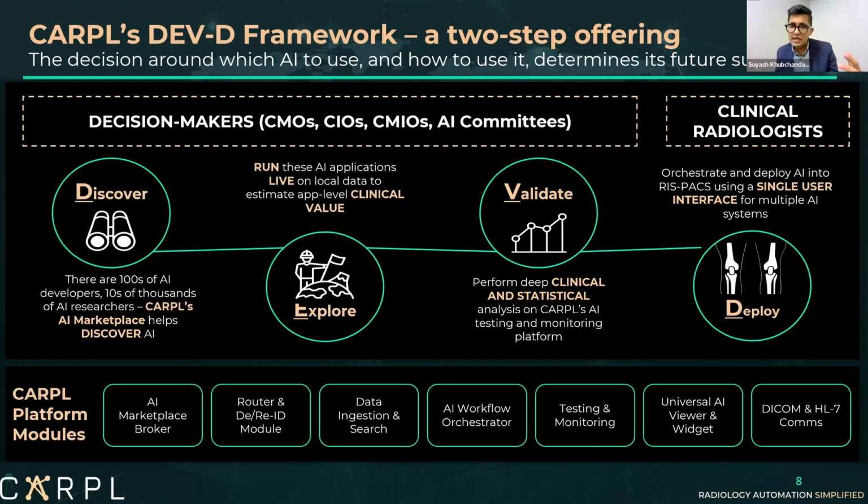Now, we're seeing in the ecosystem a lot of tools that look at oncology screens come up extensively. And that's where we find that while a radiologist may have all of these outputs sitting in their PACS system, let's say there's a lung nodule detection tool, it's detected 10 different nodules on a particular study. As a radiologist, I may agree with maybe 8 of them. And I've made a note of this and finally drafted my report and put in all of the requirements on those 8 particular nodules.